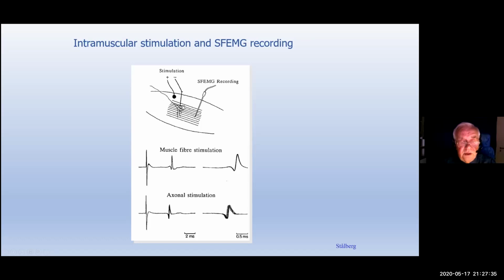So stimulus and response, there's no variability. And you see that here, no jitter. With no jitter, we mean less than 5 microseconds, because there can be some noise in the amplifier. Less than 5 is muscle fiber stimulation. More than 5 is neuromuscular junction, just one motor end plate.